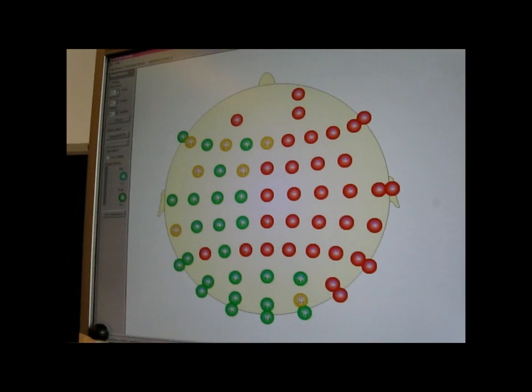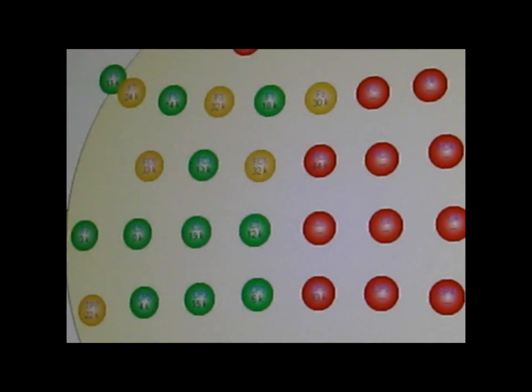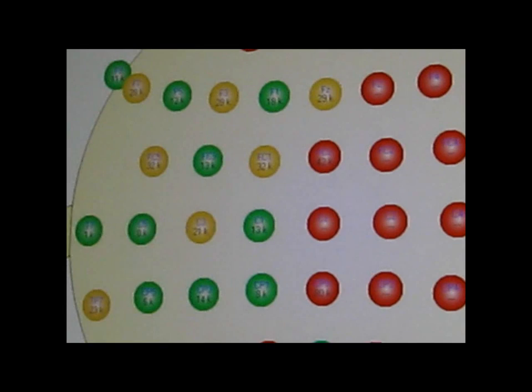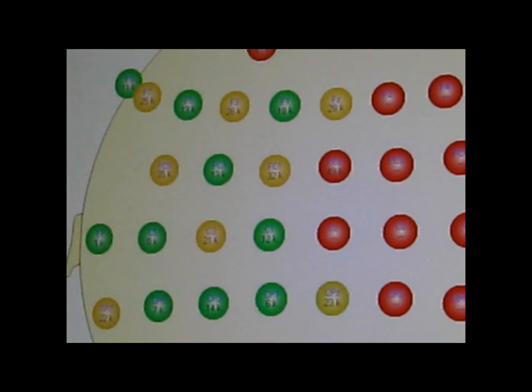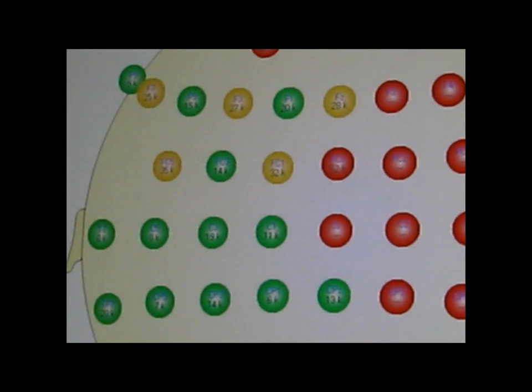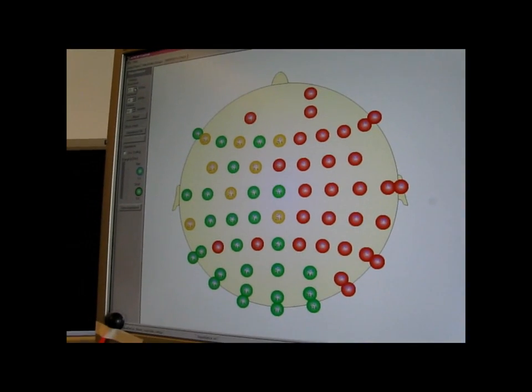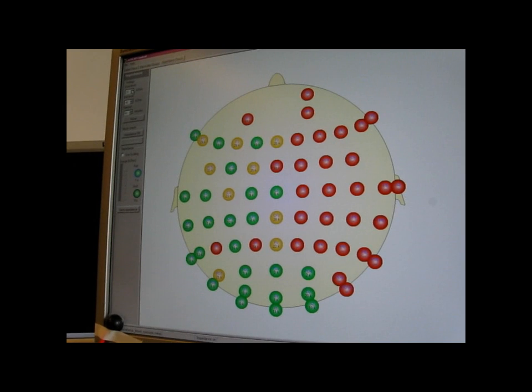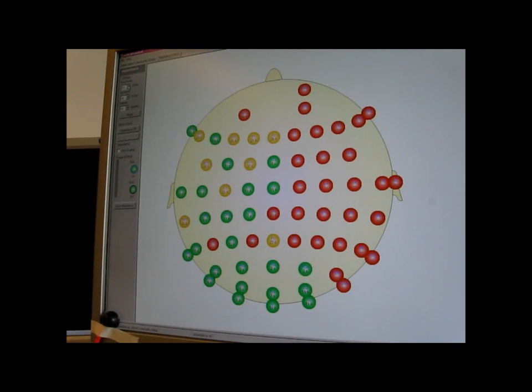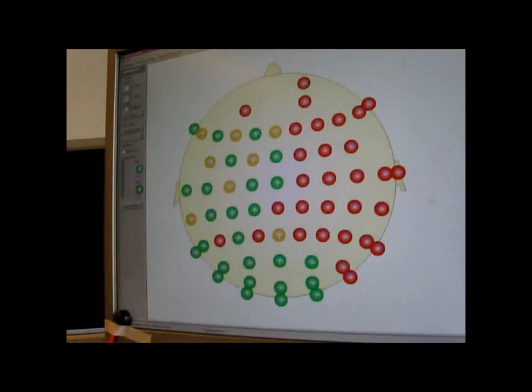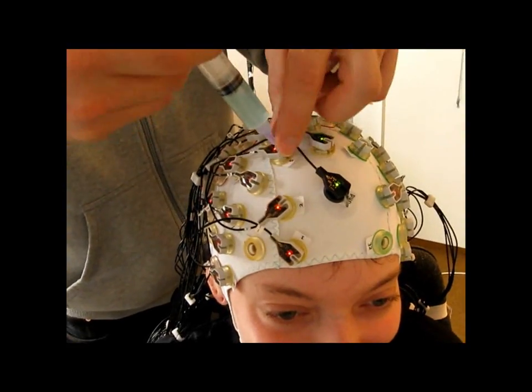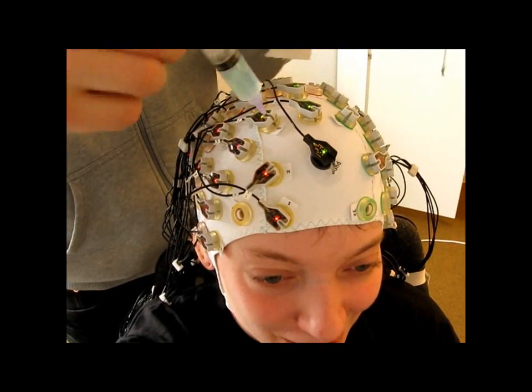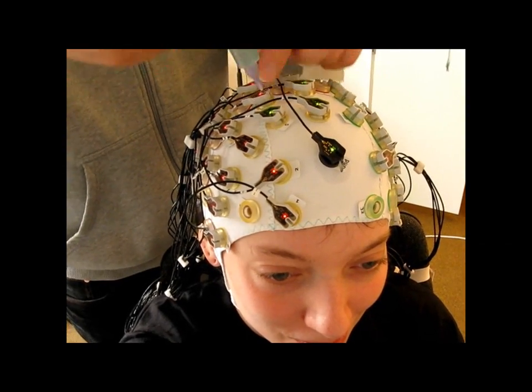The electrodes of the EEG or electroencephalogram will be able to register my actual brain waves and tell the computer about the activity that is going on, which again allows the computer to analyze it and put conclusions. You can see the impedance changing on multiple electrodes and that's because the guy behind me is just conducting electrode gel into these little electrodes.